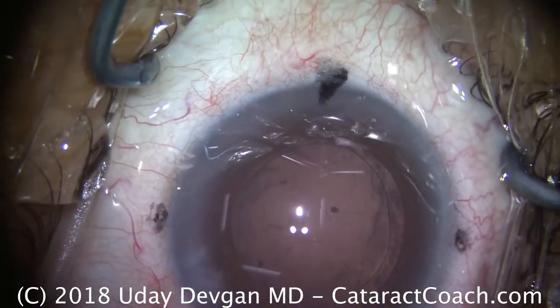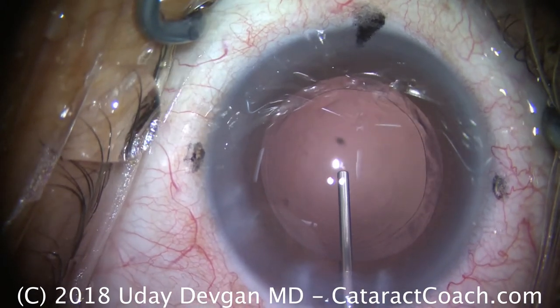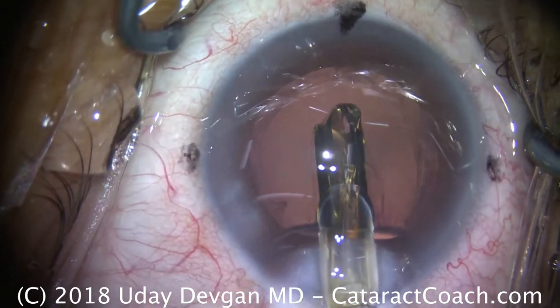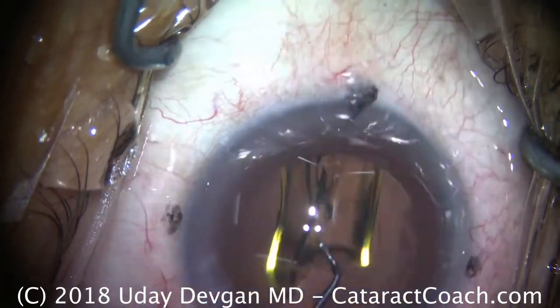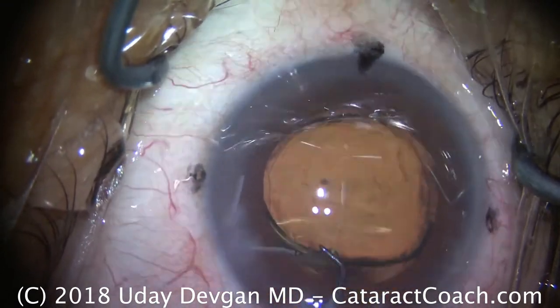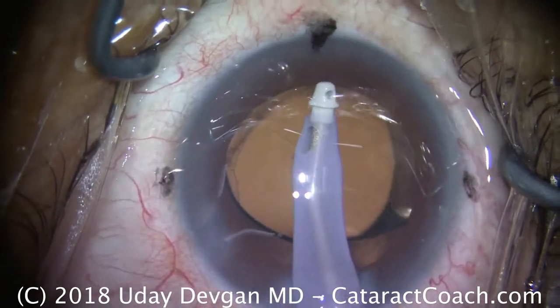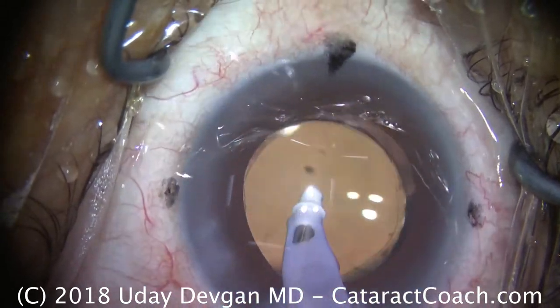Time to fill the capsule bag. We're going to use a cohesive viscoelastic, which is more solid-like and easy to remove from the eye. We fill the capsule bag — there's a nice round capsulorrhexis. We're going to place our IOL in the capsule bag: delivery of a single-piece acrylic lens right in the capsule bag. We'll use the chopper to help the lens unfold and orient it appropriately. If you orient the lens at the 12 and 6 o'clock position for the haptics, you'll be able to slightly nudge the lens nasally, which is where the central visual axis and the pupillary axis are. Going under the IOL to remove the viscoelastic — we go above, clearing out the anterior chamber, and put the IOL into good position. The capsule edges are overlapping the optic, and remember it's going to shrink-wrap down a little more — this will be just about perfect as the eye heals.